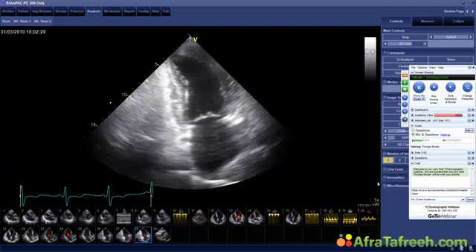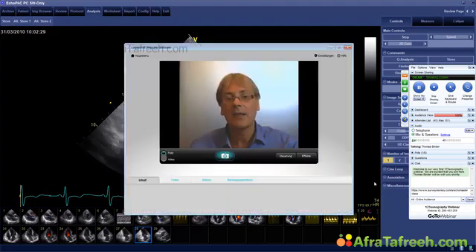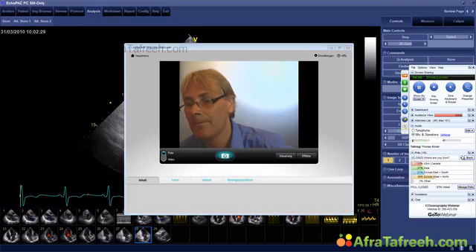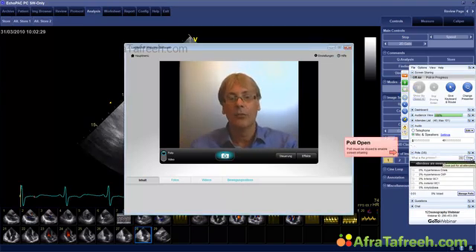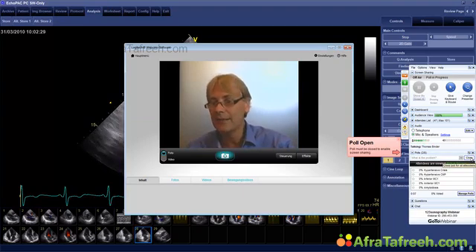Okay, so now coming back to my question, what do you think this patient actually has? And I want to show you again a poll, or ask you a question and see if you can give me the correct answer. What do you think is the problem here? Does the patient have just simply hypertensive crisis? That's why he has chest pain and dyspnea?